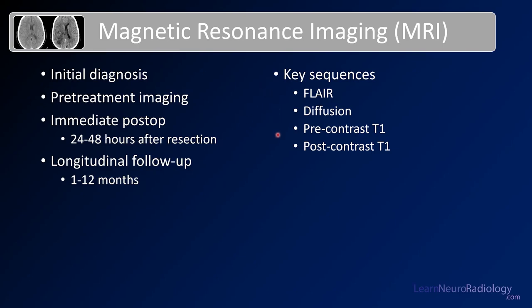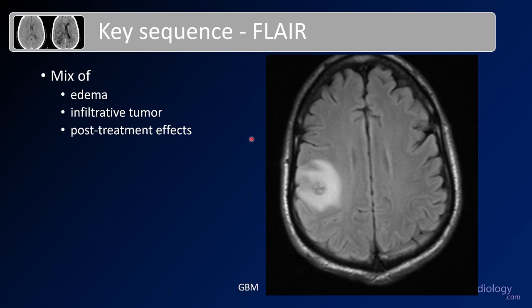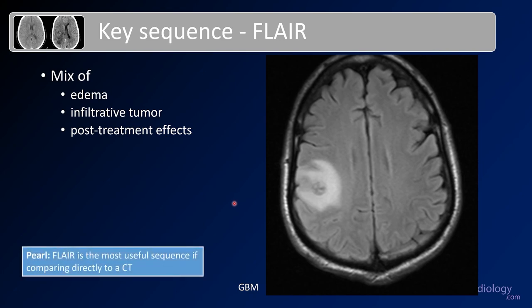Key sequences obtained every time include FLAIR, diffusion, and pre- and post-contrast T1. FLAIR is a really key sequence — here you see a FLAIR image on the right of the screen showing a mix of edema and infiltrative tumor, and you can also see post-treatment effects like gliosis from radiation therapy. The enhancing part of the tumor is surrounded by hyperintense FLAIR signal, which is a combination of vasogenic edema and infiltrative tumor. FLAIR tells you the extent of the abnormality, how much brain is involved, and how much overall swelling there is. FLAIR is the most useful sequence to compare directly to CT — it's kind of the inverse, since water is brighter on FLAIR but darker on CT.